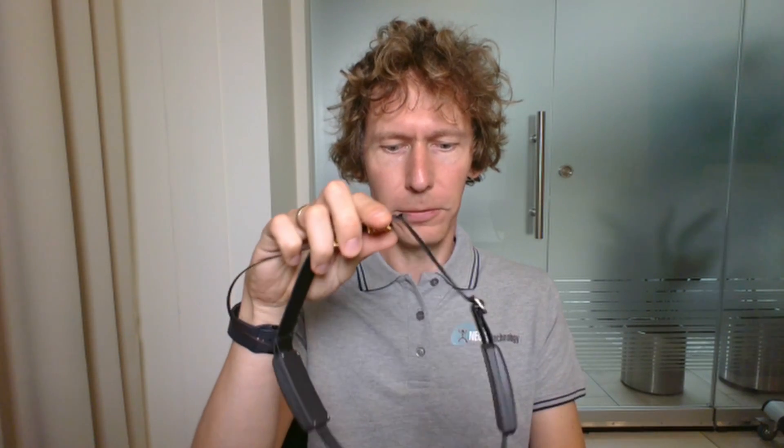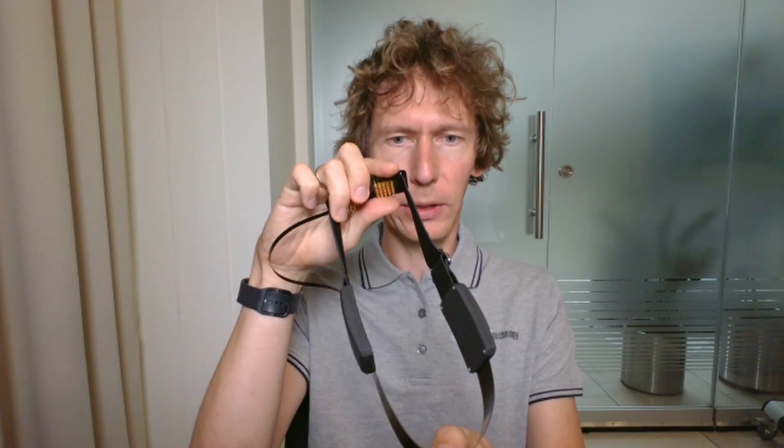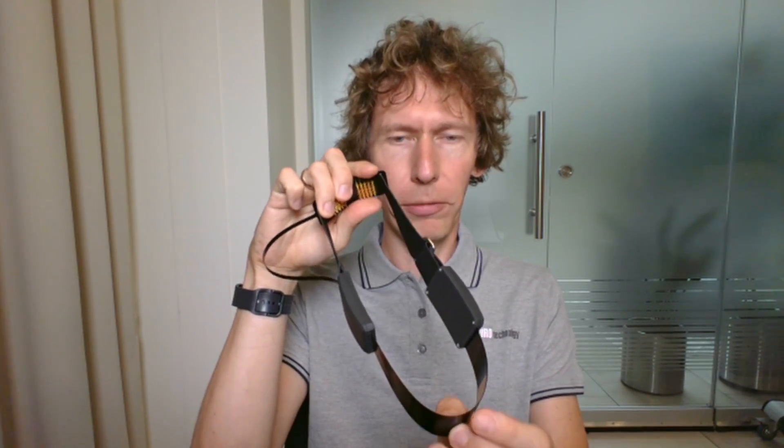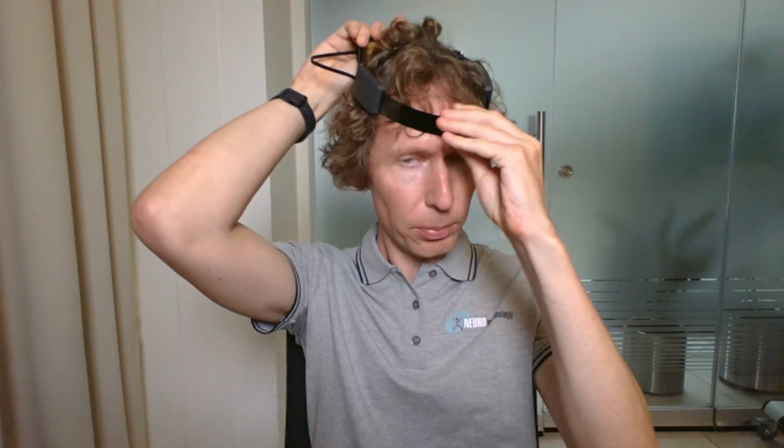Let me show you how to correctly put it on. First, position the reference electrode at the midpoint of the forehead and then lower down the back part. Once on, you can adjust the back electrodes so they are over the occipital region. You can move them up and down or left and right.